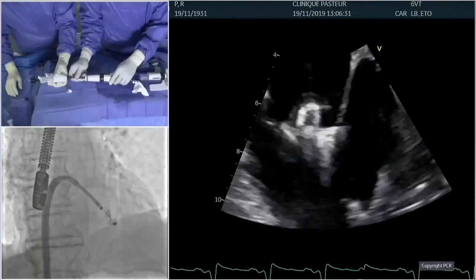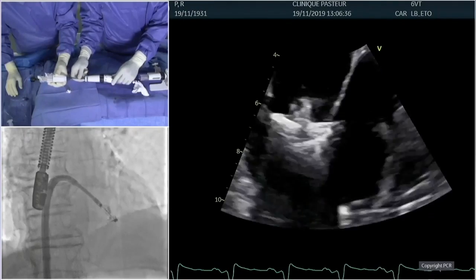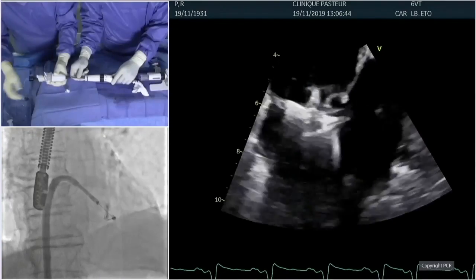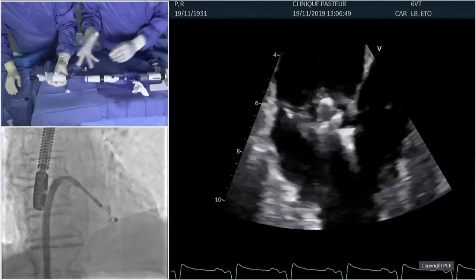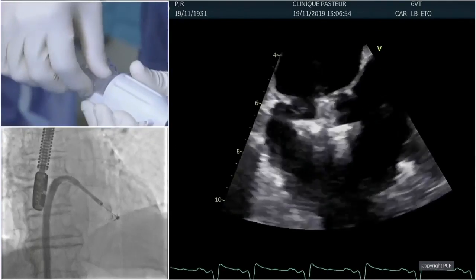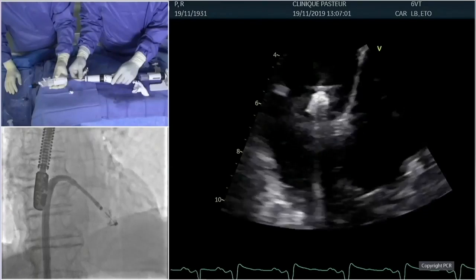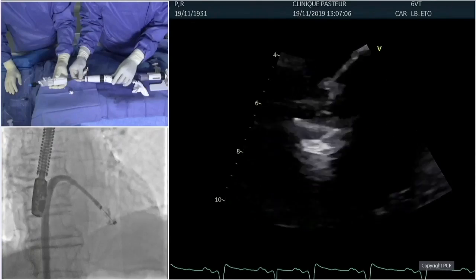Okay, so now the posterior clasp is fully up. Let's aim at getting it into position. Okay, Nico. And now the posterior. Release a little bit the tension. Yeah, the posterior is challenging to capture. Let's try it again. We have that differential, so it's good because we don't have the anterior to deal with now. So we're going to optimize a little bit the echo image just to see the posterior.